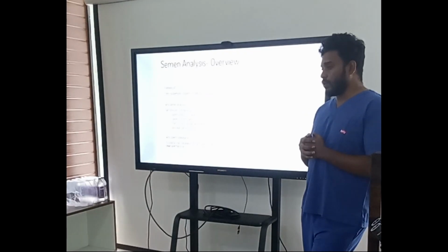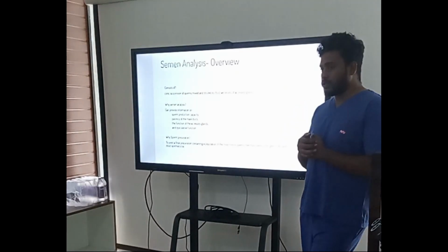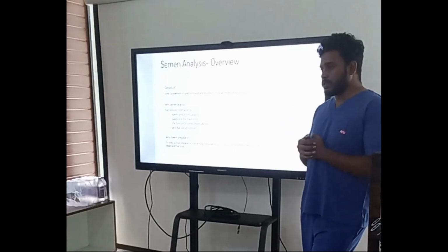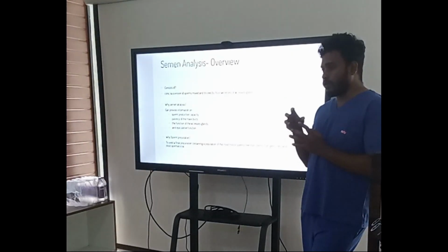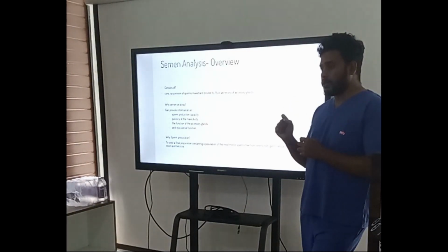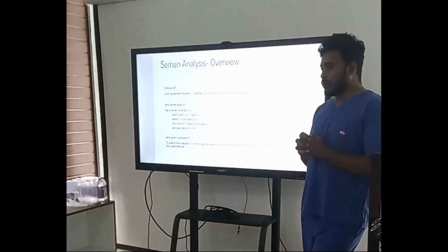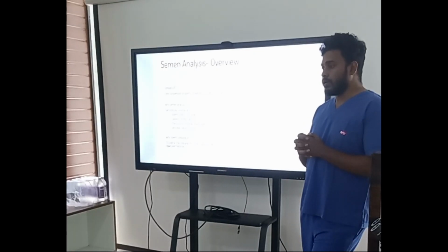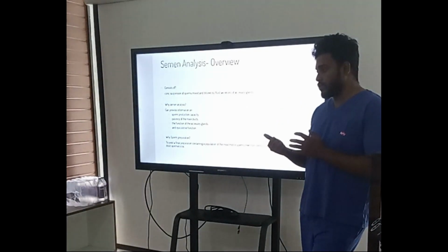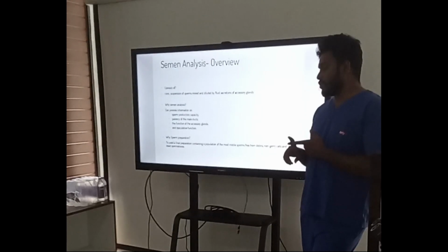If you are going ahead with IUI, there is a hormone called prostaglandins. Once it enters the uterus, because you are going to deposit the processed sperm inside the uterus for the IUI, and further it will proceed to conception. When prostaglandin is present in that prepared sample, the uterus will contract. Once the uterus contracts, you will not have a smooth flow in that hostile uterine environment for the sperm to go and fertilize the oocyte which is waiting. So that is essential for IUI.